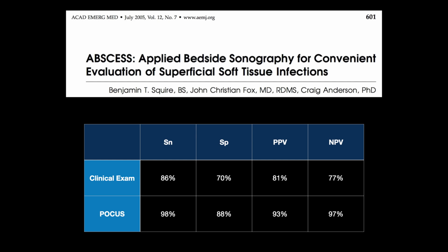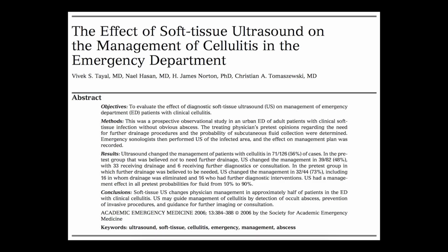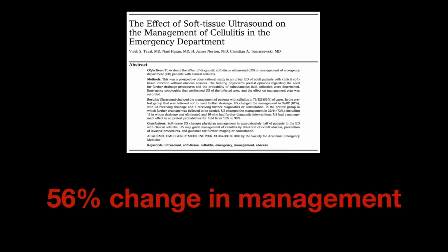We talked a little bit about this before, but here's a study that was published by Vivek Tayal. This one was published about the same time, almost 20 years ago now. But basically it looks at, when they did the ultrasound, did the provider change what they're going to do based on the ultrasound that was performed, right? And what they found is that there was about a 56% change in management when you did an ultrasound on the patient. And this is where I mentioned that Jen Marin's study nuanced it a little bit into categories of did you know what was going on versus did you not know what was going on. And the 56 is a little bit of a bullish number when you have clear evidence of one versus the other. But when you get into that category of we're not entirely sure what exactly is going on, this is where the ultrasound can provide a huge benefit to helping you out and helping your patient out.